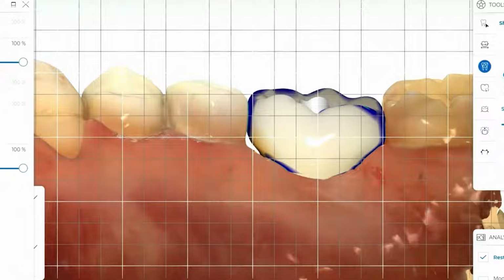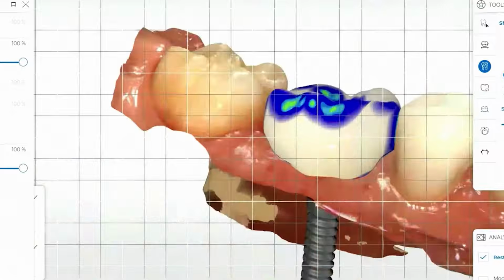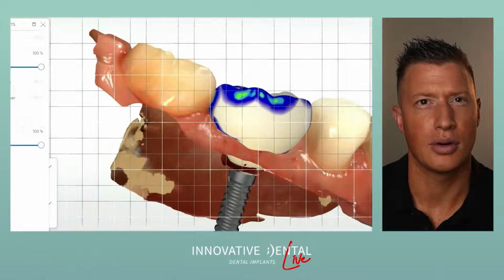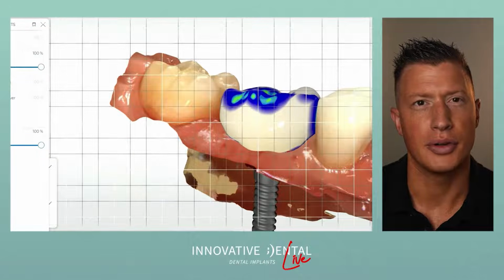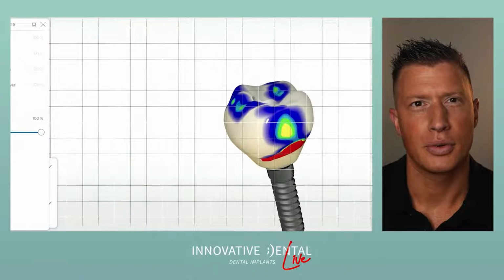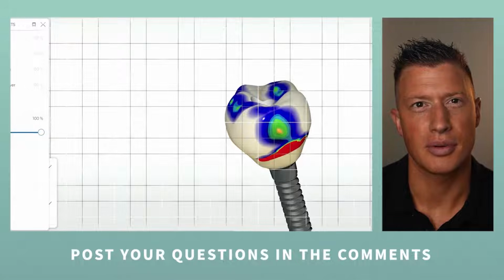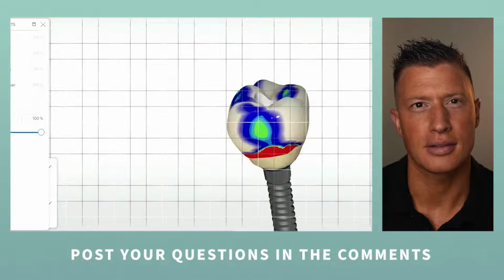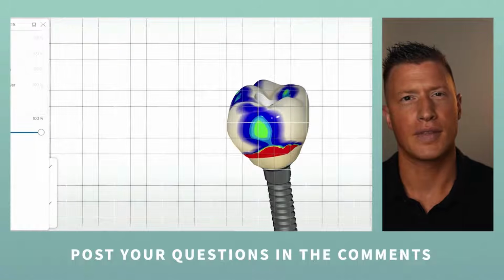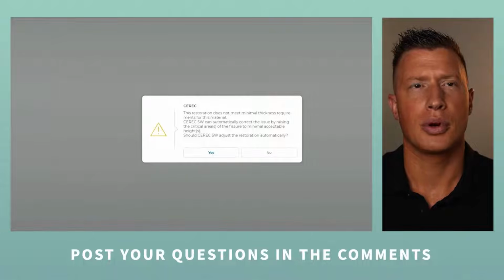Oh, you notice I picked something else up. There's the contact, right? The tissue pressure I was talking about. I'm going to give a little bit better tissue pressure. So that's what I was doing, is adding a little bit more so we don't have any hygiene issues, right, where we're trapping food. Like to avoid those. I don't know if you've ever had a crown or dental work and all of a sudden you start trapping food, but that's usually something that we can address and fix and be pretty meticulous about. So that's how we limit it right there. So we planned it, get it ready to mill it, and then put it in.